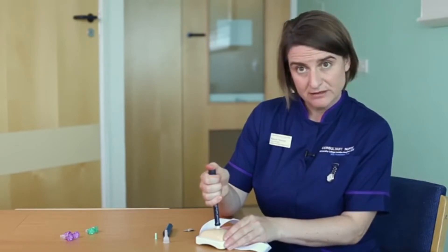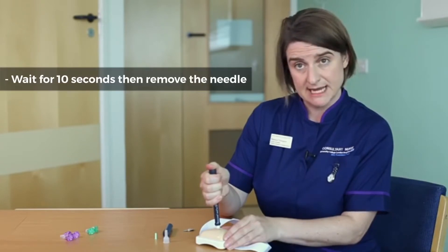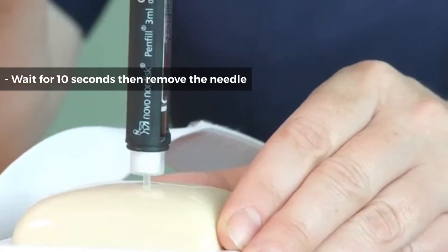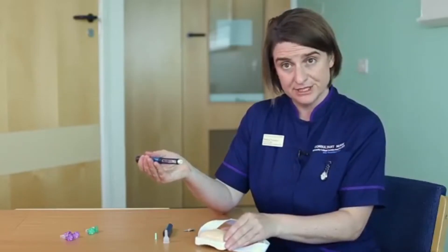Once you've pushed as far as you can go, you're going to delay removing the needle for a count of ten: 1, 2, 3, 4, 5, 6, 7, 8, 9, 10. At this point, you can take the needle away from the skin and you've done your insulin injection.